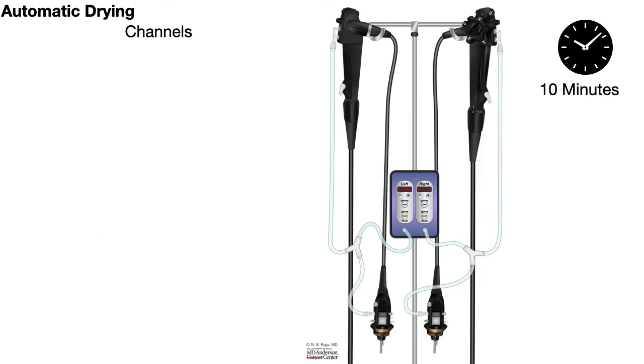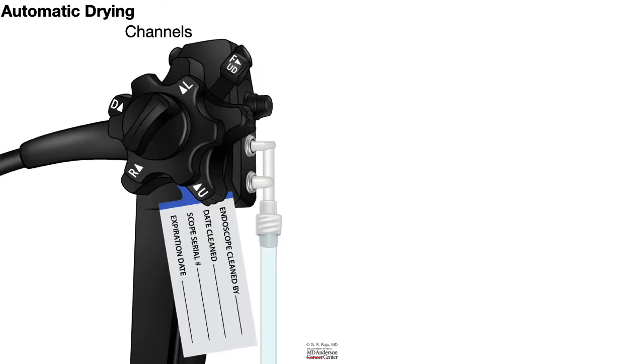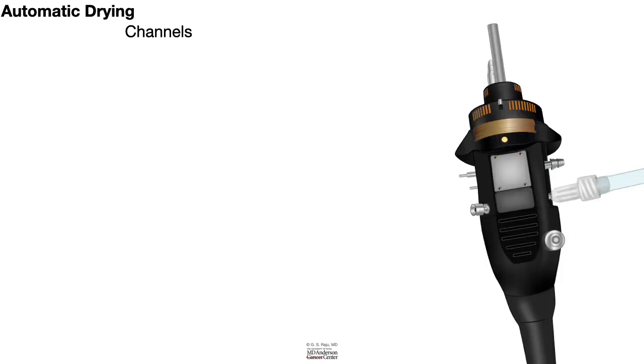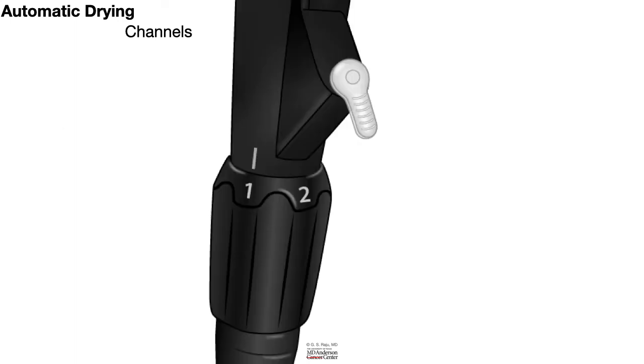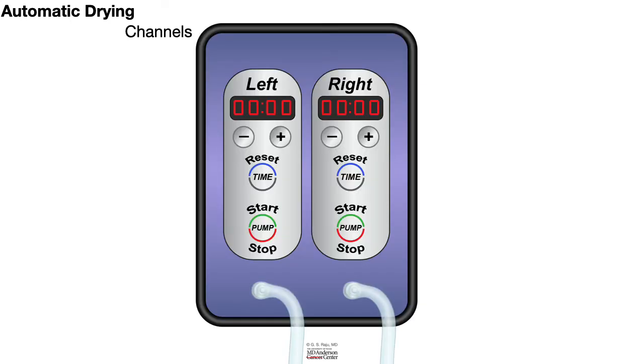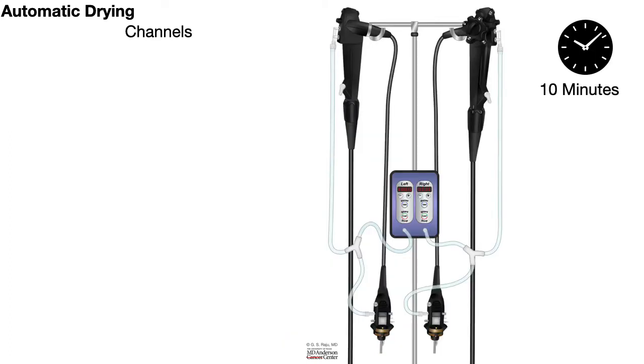If you decide to do automatic drying with this machine, this is how you go about doing it. You attach the air, water, and suction channels to a tubing and also to the suction outlet. Then plug the biopsy port and attach those tubings to the pump. You turn on the pump and it goes for 10 minutes and dries up all the channels.